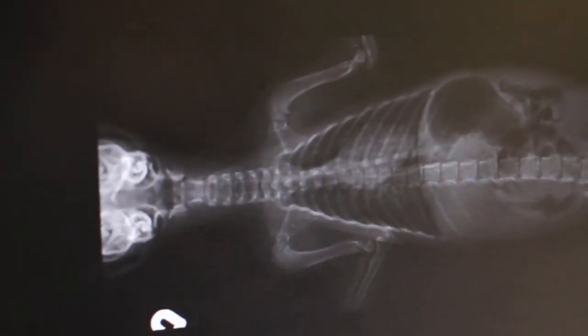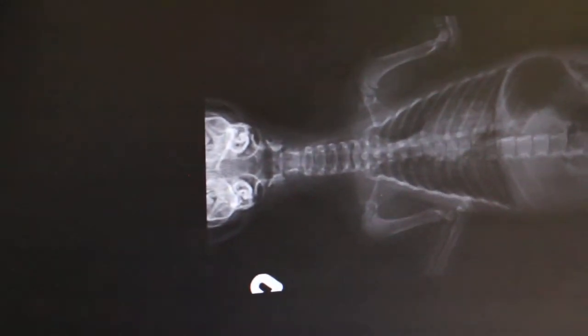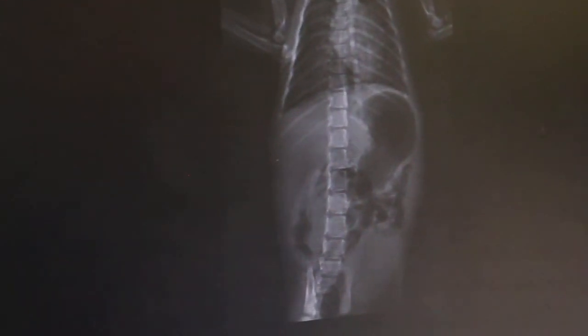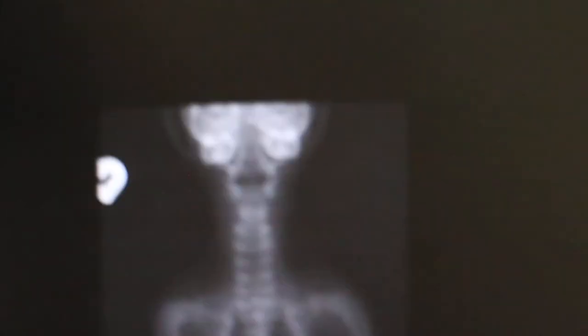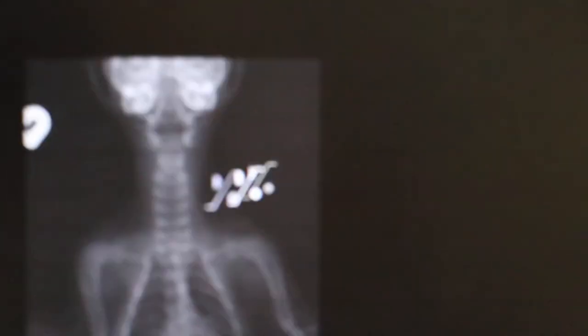Come already, yeah. Never mind. Wait, I can see from here though. Wait, Doc. Okay, the ventral dorsal. This is the right. So I put the bone here. Still okay. Cannot see. Never mind, just brighten it. It's not a bone, it's supposed to be a plastic. If it's a bone, you normally can see. The throat is so clear.